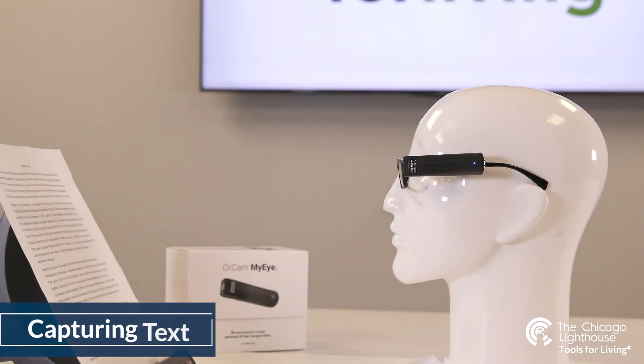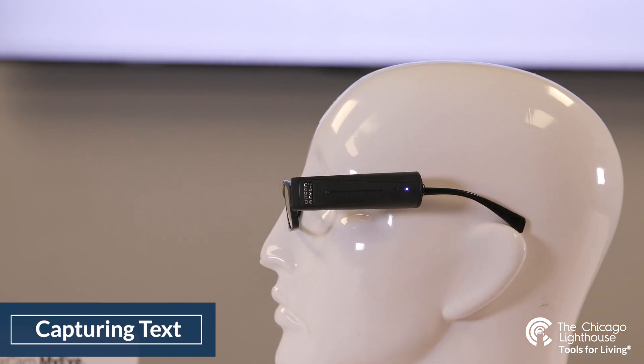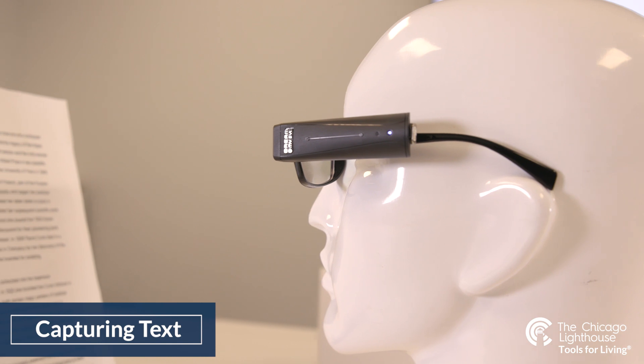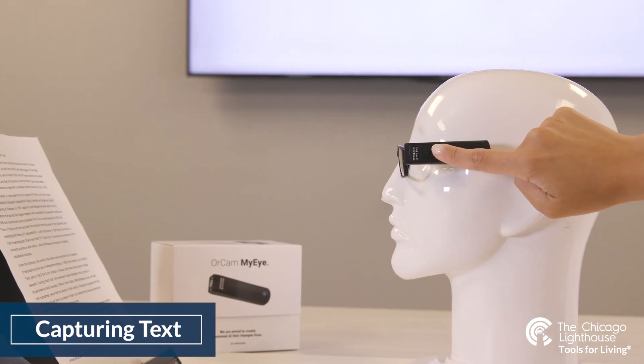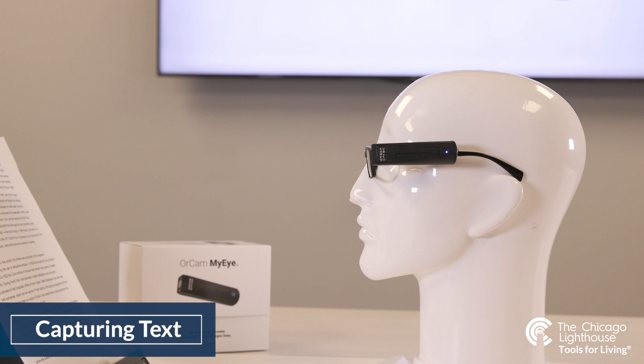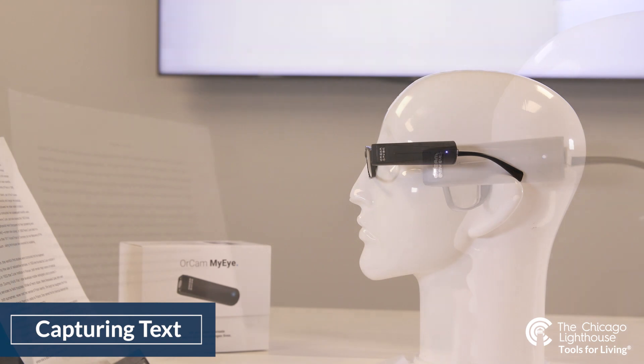There are two methods of capturing text with the OrCam device. The first is capturing a full page of text. If you want to know what is on a full page, take a photo by tapping the side with the flat of your finger once. This method can read anything and everything that is printed text in front of you, from a reasonable distance and with a 70-degree field of vision — meaning your device can read a poster in front of you or even grocery store aisle signs.